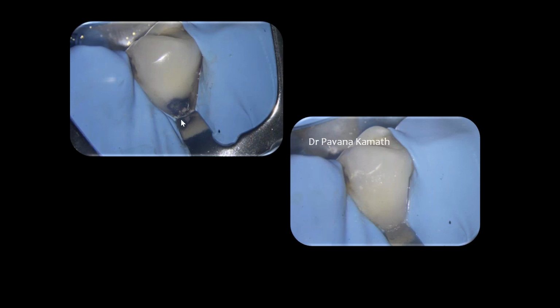In this case, the isolation is being performed with a B5. The prongs should sit exactly at the line angles of the tooth, at the margins. If it goes beyond, the stability of the isolation is lost. And hence, we have to know exactly where and how much of engagement is needed, and accordingly you will choose whether you will go for the B5 or the B6 clamp.